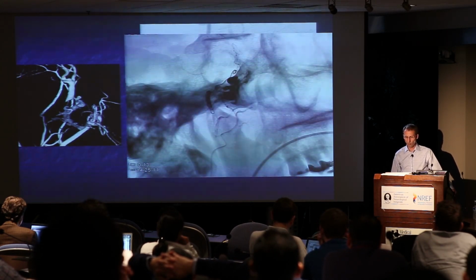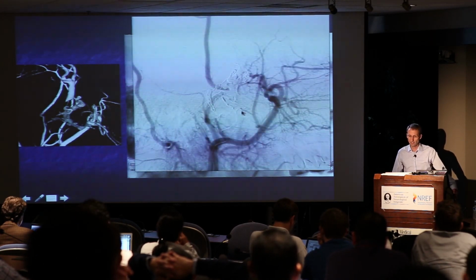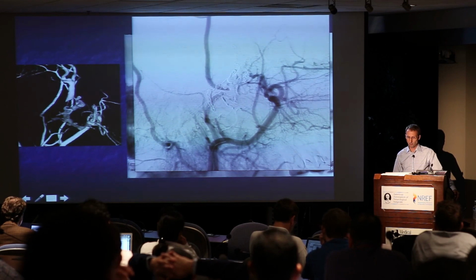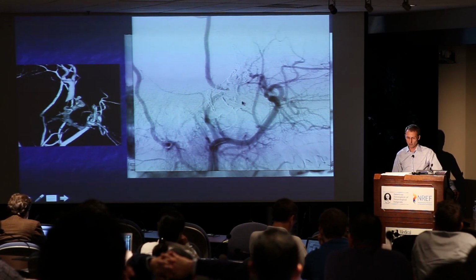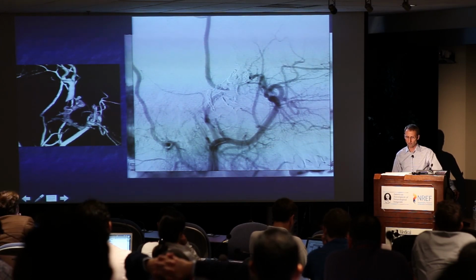We didn't see any worrisome reflux or onyx going where we didn't want. And then with the follow-up angiogram, this appears to be now completely obliterated. Again, the dural fistula, we believe, is in this location. We filled the venous pouch completely, because again, you want to saturate the fistulous connection and get it into the main venous outflow, if possible, to completely eliminate it. And these are the coil mass in the MMA and the onyx cast, which hopefully you can see a little bit, that was cured.